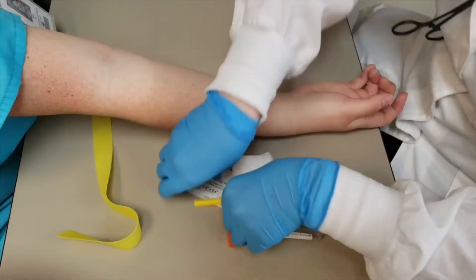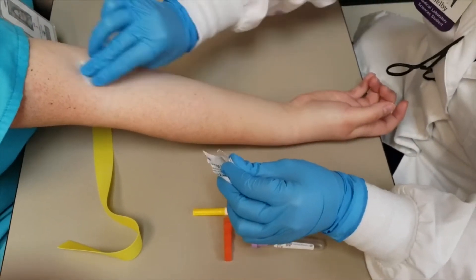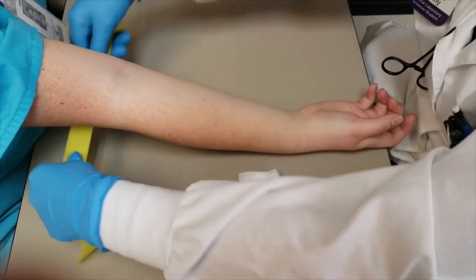Then you're going to clean the vein puncture site. You're going to take your alcohol swab and clean it — make sure it's nice and clean. You're going to let that dry and put the tourniquet back on.